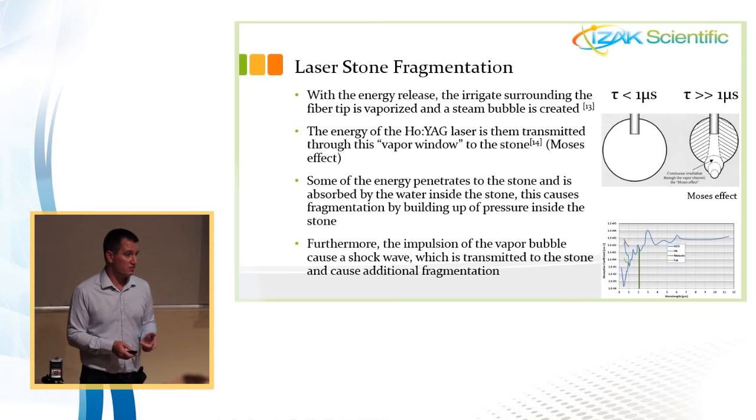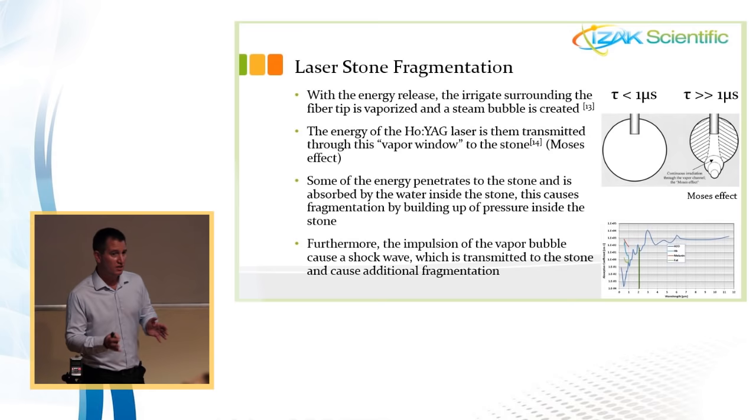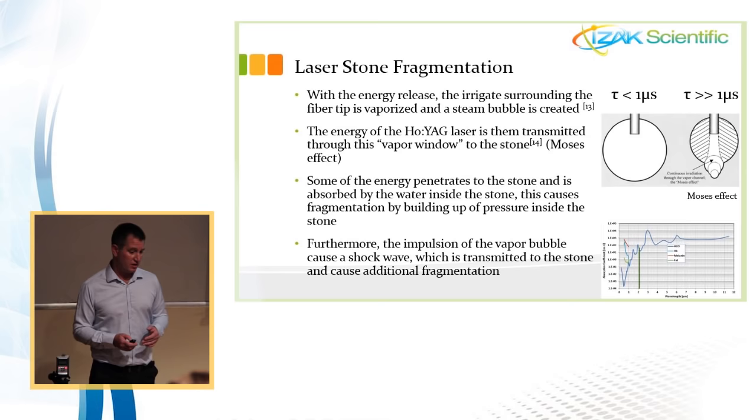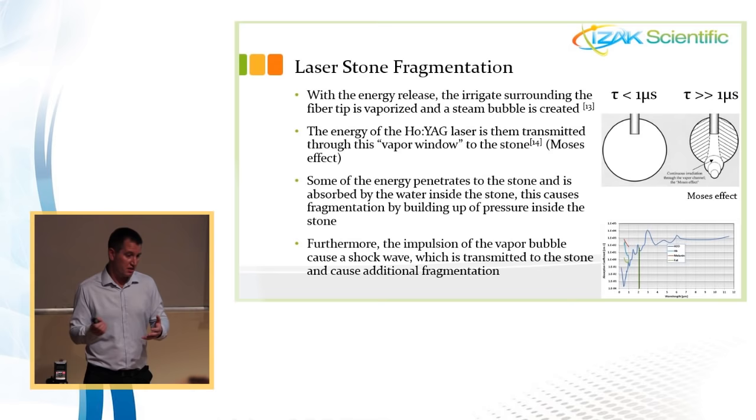And then, if it's close enough to the stone, it transfers the energy to the stone. It's called the Moses effect, from our history, where all the water goes to the sides. Part of the energy goes to the stone and is absorbed in the water inside the stone and builds up pressure. On the other side, after the bubble collapses, there is an optical breakdown and a shockwave, which is responsible for the stone fragmentation.